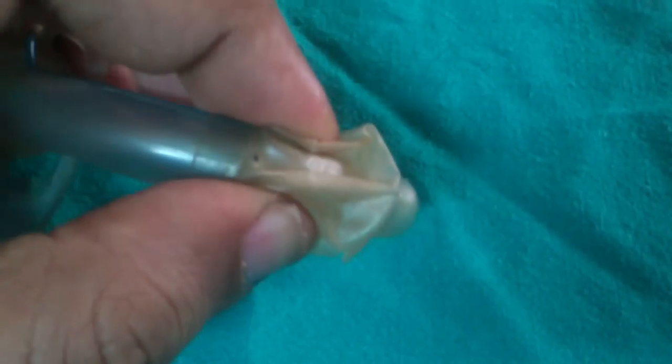In such cases, we will use what is called the Portex Tracheostomy tube. The Portex Tracheostomy tube has an inflatable cuff that secures it into position.